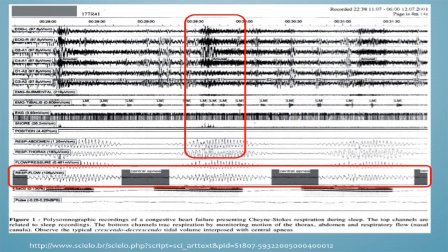Moving into more channels — this is a polysomnograph trace. As you can see there are many, many channels to display and observe, so it takes a trained eye and time to validate this data. During periods of increased effort you're getting arousal in the EEG traces — it's taking the patient out of a deep sleep and putting them into a lighter sleep.